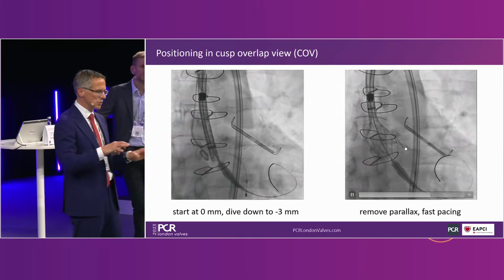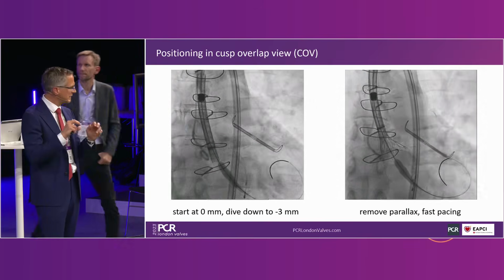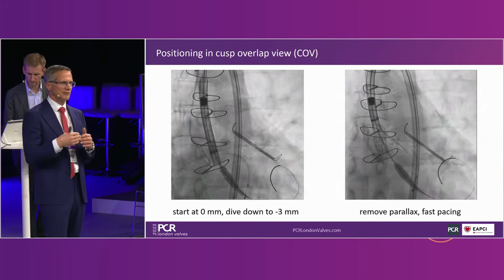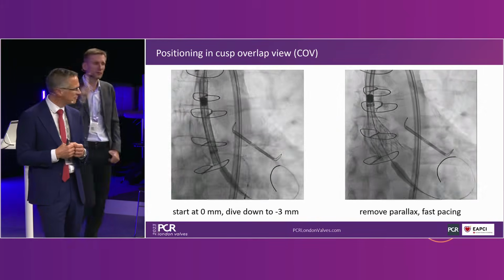So therefore, I know that with this gold marker here on the inner curve, there's a commissure. And the 2 to 1 means after implantation of the valve, I check the placement of the gold markers and coronary orientation, that I've got no commissure in front of the coronary. I made a drawing on top, but Tobias, for the sake of time, we still have another case, so I think you should move on and show what you did and then the end result, and then move to the next case.